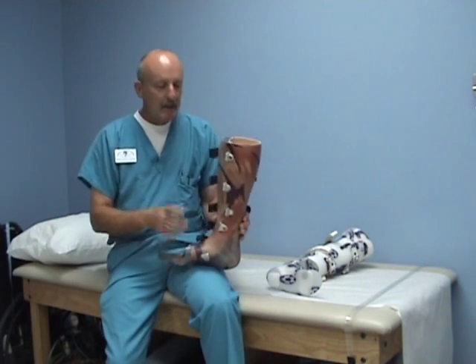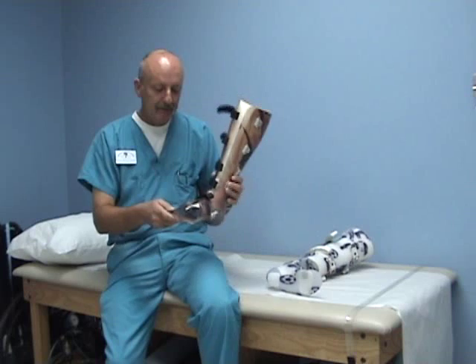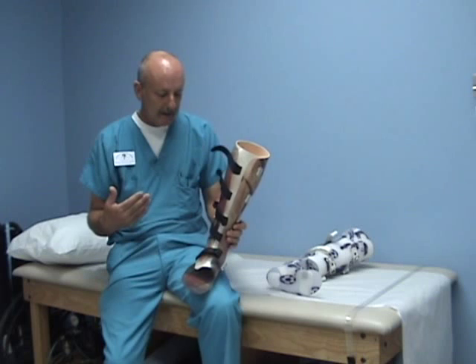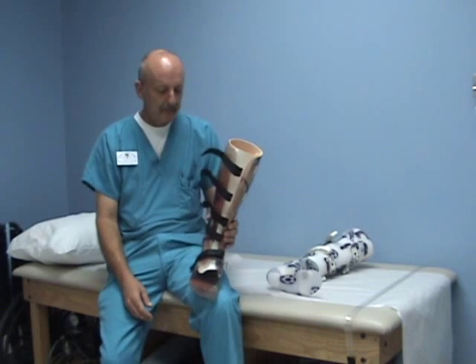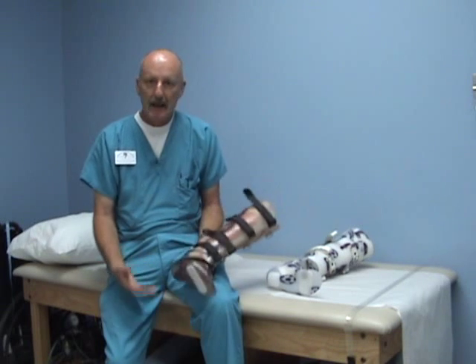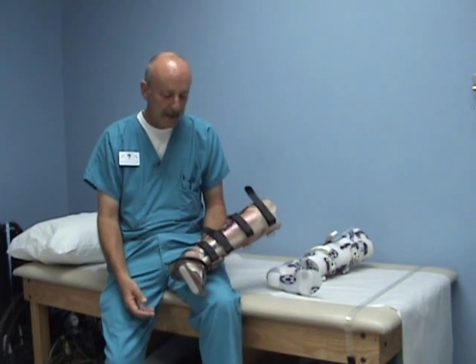I like this design because of the total contact, intimate fit, and very thin plastic that fits in shoes, which allows very diverse footwear selection. It is very effective. It works basically like a cast, but it is very effective at unweighting.